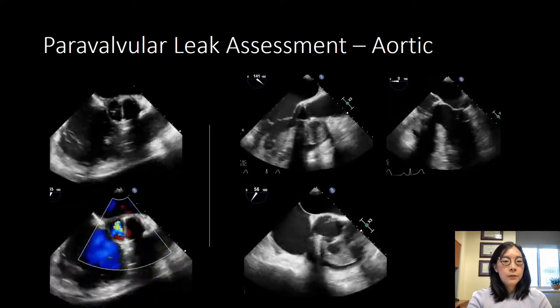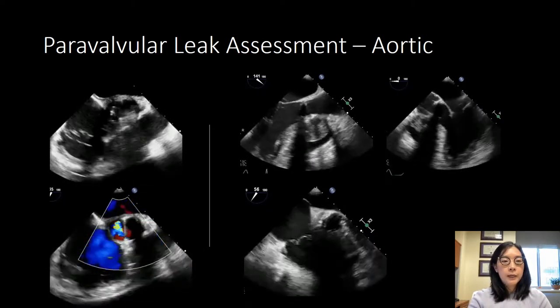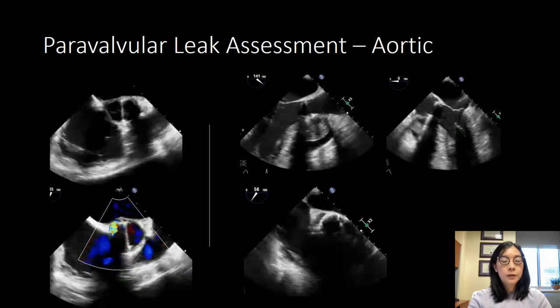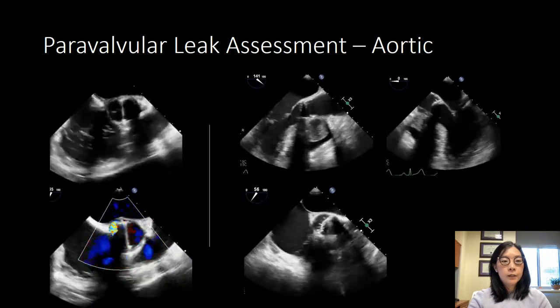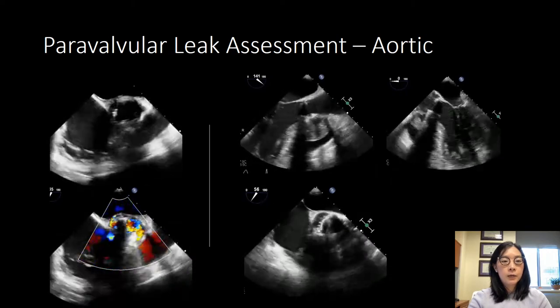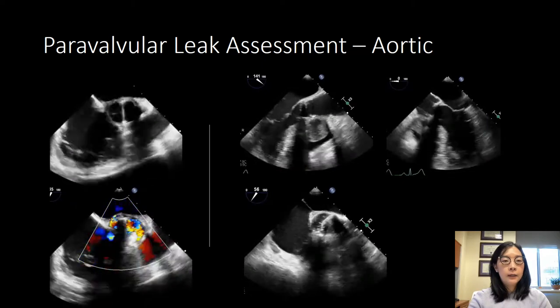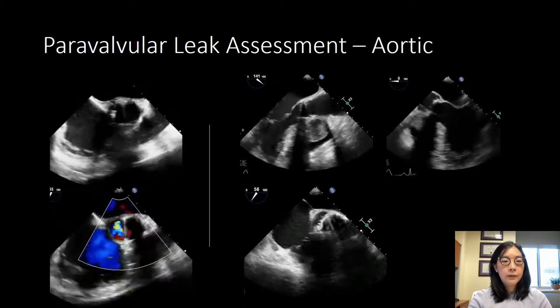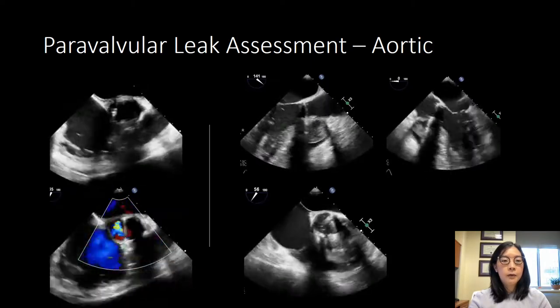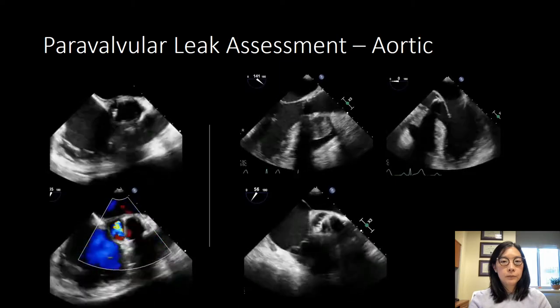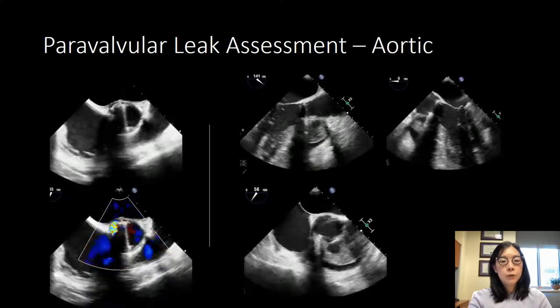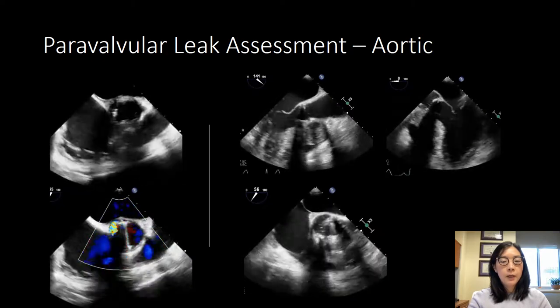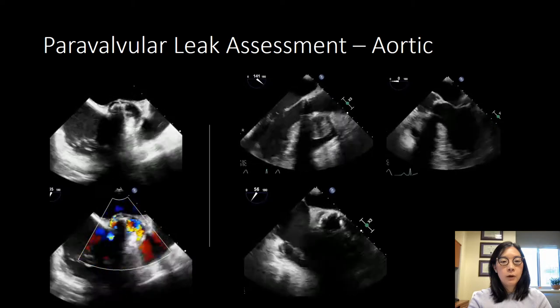Once we've done the transgastric views for aortic valves, we come up to the mid-esophageal. Here you can see examples demonstrating why the posterior annulus is well seen on transesophageal echocardiograms versus on transthoracic. This area tends to be shadowed with mechanical aortic valves. In contrast, on transesophageal echocardiograms, the anterior annulus of the aortic valve is heavily shadowed and difficult to see. In the mid-esophageal views, we typically sweep from side to side or up and down from the LVOT up to the aorta in order to ensure that all jets are identified.